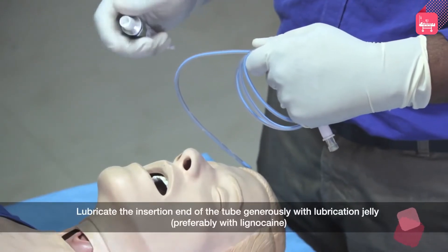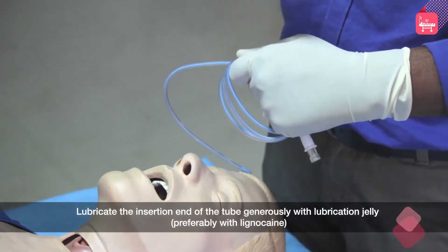Lubricate the insertion end of the tube generously with a lubricating jelly, preferably with lignocaine.